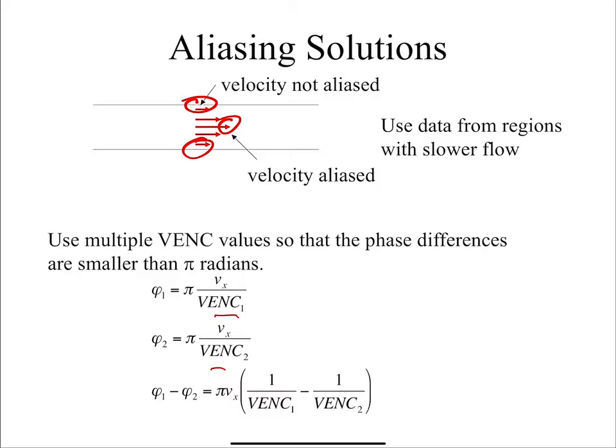If you're looking at a particular blood vessel, can you say that you know which way the blood is flowing and then interpret up to 2 pi instead? That it is going right. Yeah, but you would want to know. The phase contrast gives you its estimate of direction.